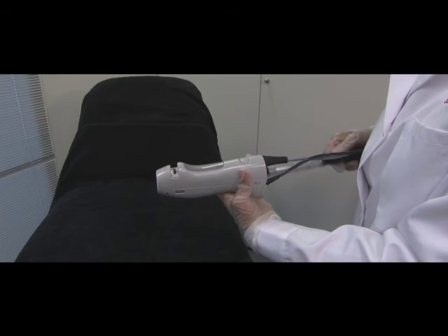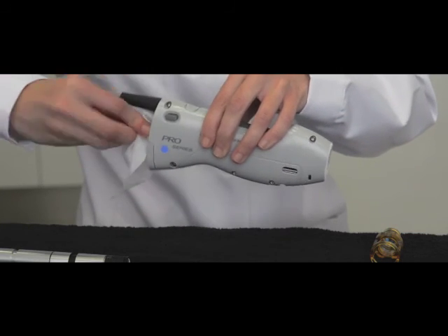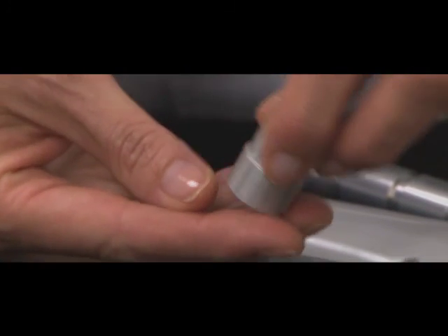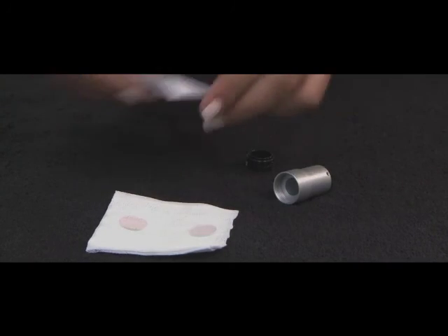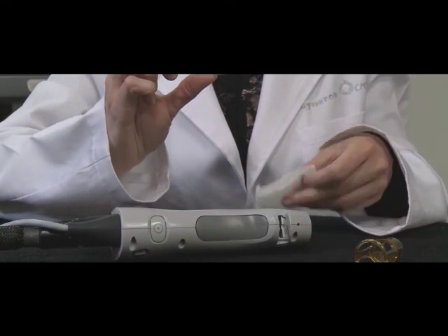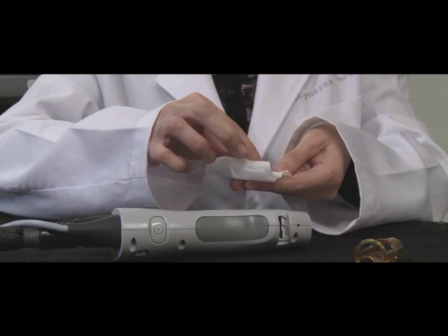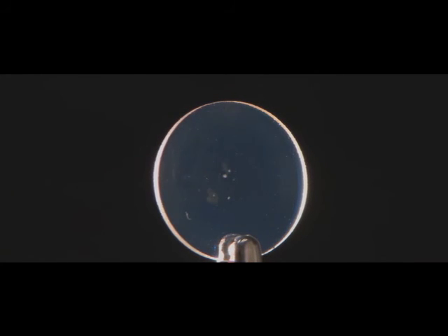After each treatment, clean the inner slider area of the handpiece and the outer slider as demonstrated. Check the slider window after each treatment and be sure to clean as needed. If there is any imperfection, change the window. As mentioned earlier, the handpiece windows should be cleaned after each treatment with isopropyl alcohol and soft gauze. Unlike the slider window, they can be used with slight imperfections.